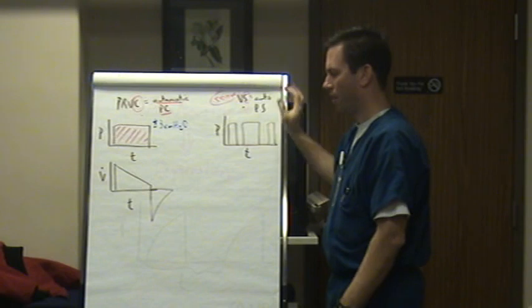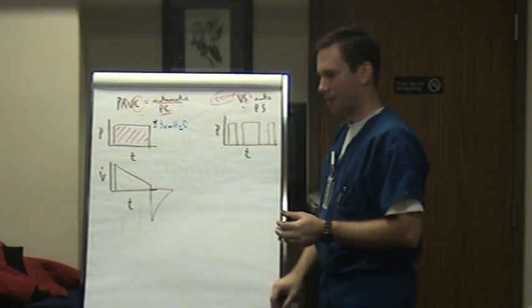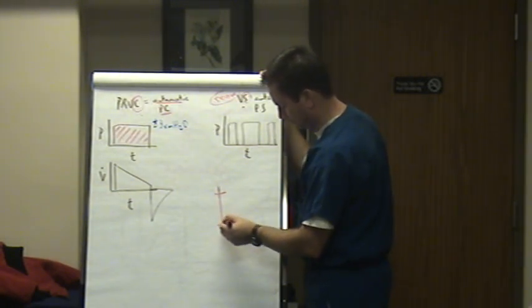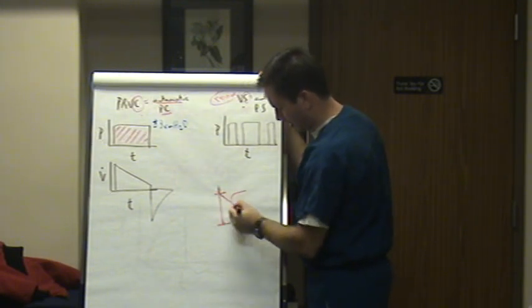So that's volume support. Do you have any patients on volume support today? Any of your patients at all? If you do, you can tell how much work the patient is doing versus the vent. For example, I'm just going to draw this out. If the patient is on, let me draw this out.